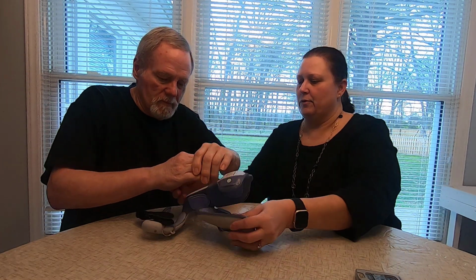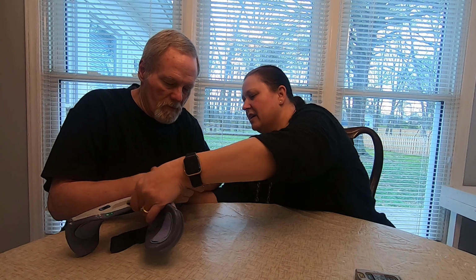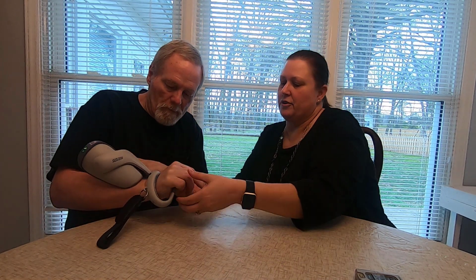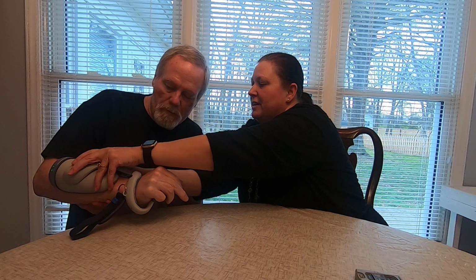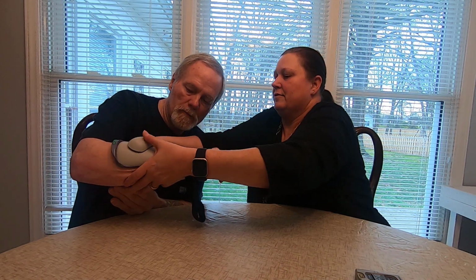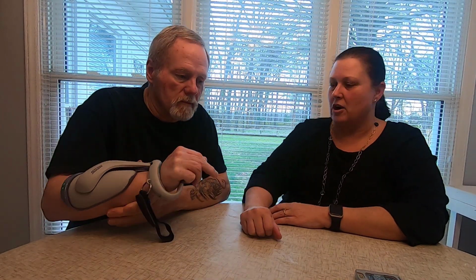So I'm coming at it from the wrong side. This part of it comes up under his hand, so it rests on his palm. And I can't squeeze it. Yep, he can't do that himself. Hang on a minute, let me. Okay, go ahead. Oh, you got it? Yeah. So you have to squeeze it really tight like that to get it to be tight on there.